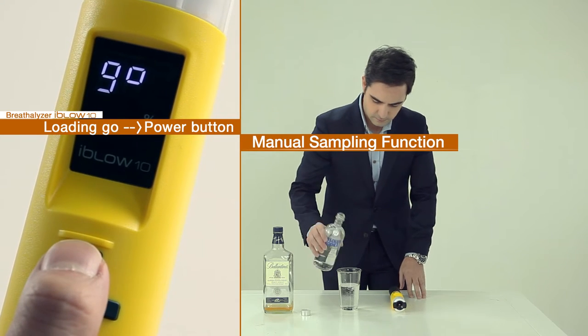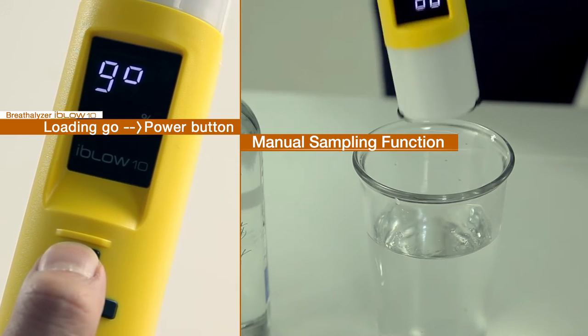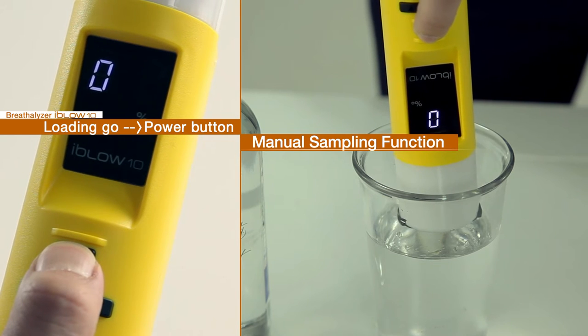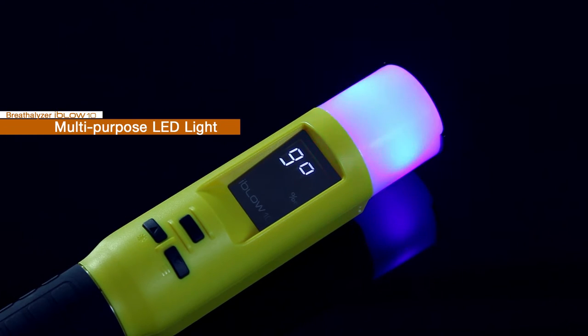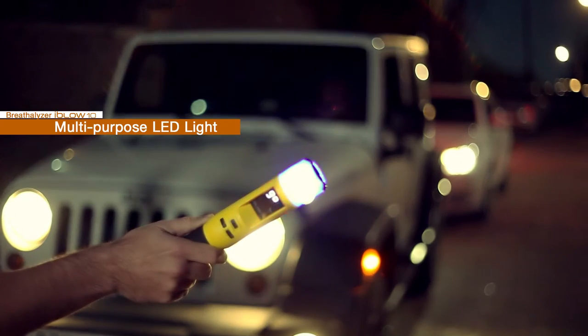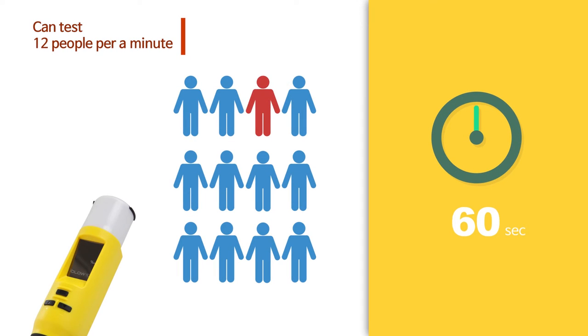If the subject did not breathe out hard enough, or when checking the alcohol content of a drink, press the power button once at GO mode for manual sampling. At night, go to the light mode to use the light. Continuous testing is possible.